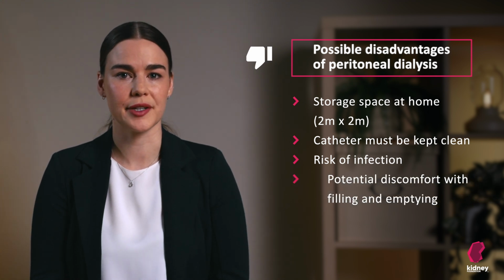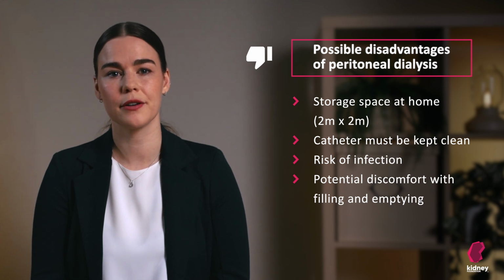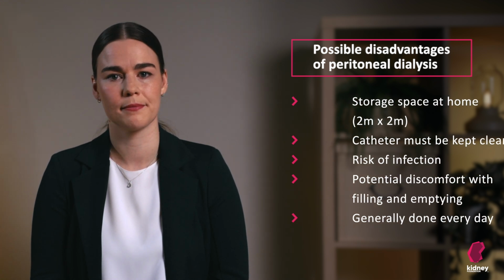Some people experience discomfort when filling and emptying the abdomen with the dialysis fluid. If you are experiencing discomfort, this is something you should discuss with your healthcare team. You generally have to do dialysis every day.